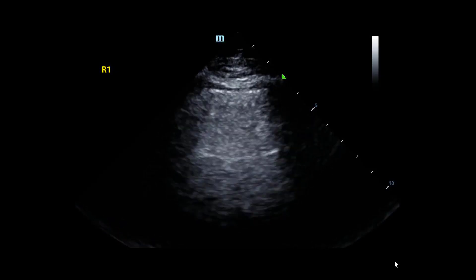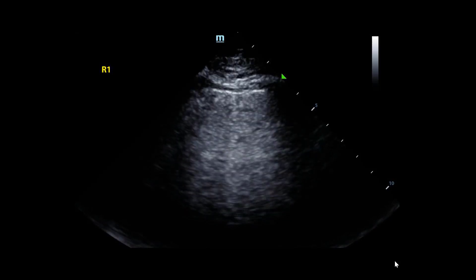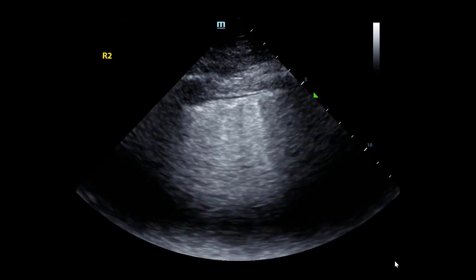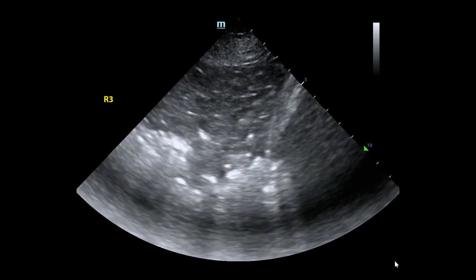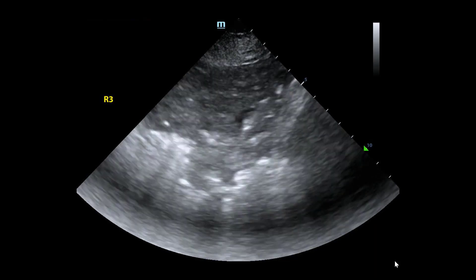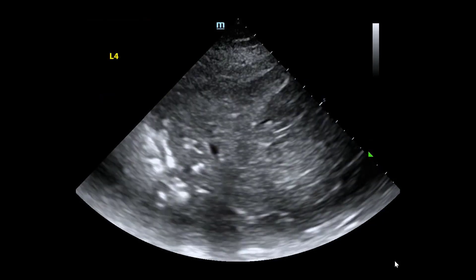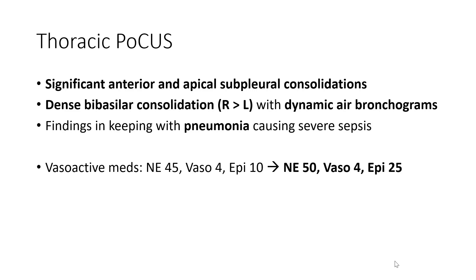An initial lung scan, given the concerns about pneumosepsis, was performed. We see the right anterior chest wall view demonstrating an A-line pattern, right anterior axillary line demonstrating evidence of B-line pattern, a right costo-phrenic angle demonstrating evidence of dense consolidation including a dynamic air bronchogram seen near the top right of the screen, and a left PLAPS view demonstrating dense consolidation as well.